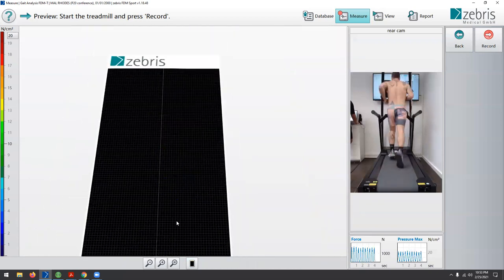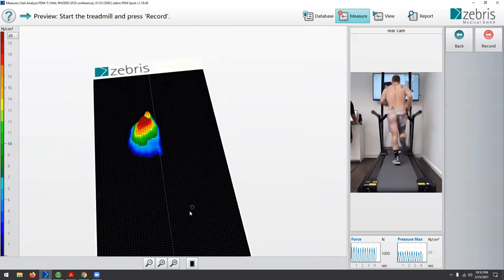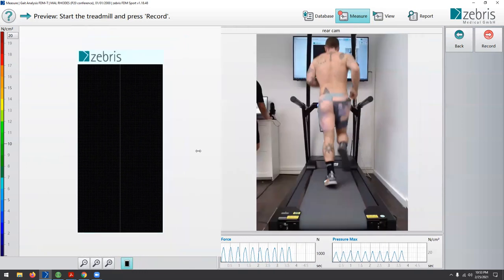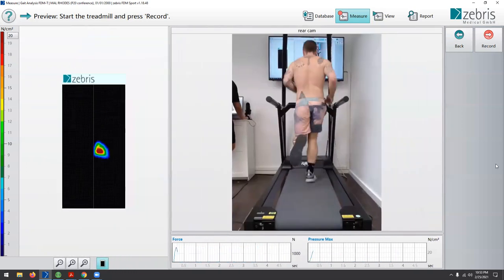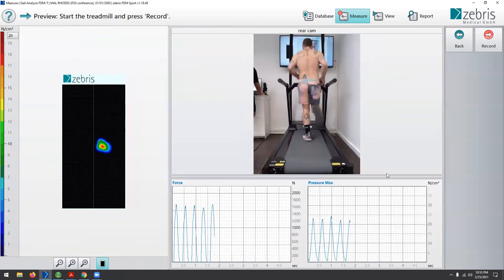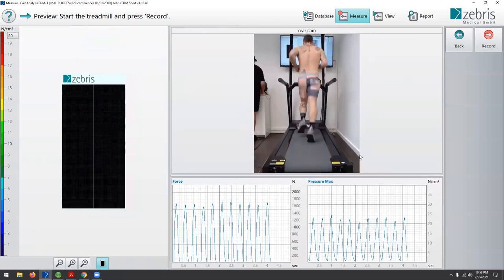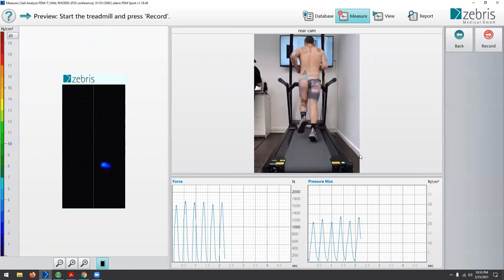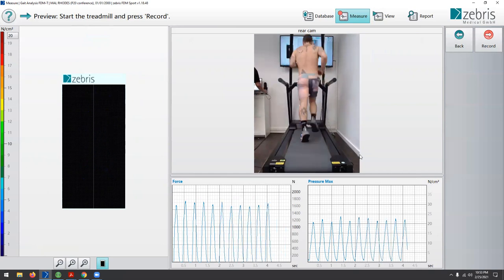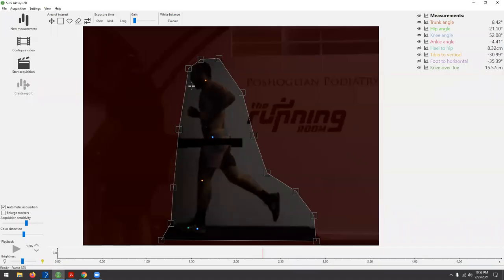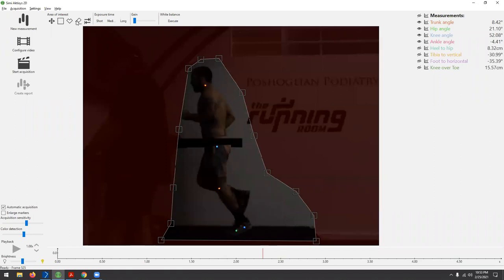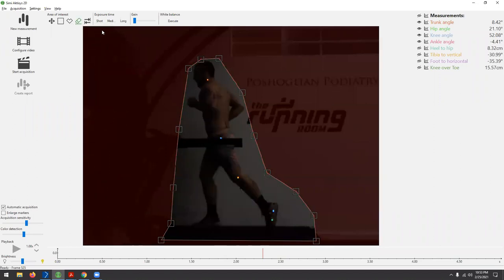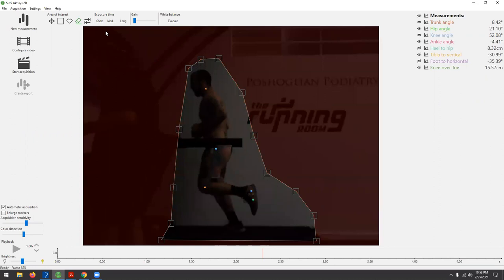I can drag this around and look at exactly where load is going to the foot. We take a thirty-second sample of what the runner looks like while they run. We're just habituating Mel to the treadmill here — he had already been running for around five minutes before we jumped on.